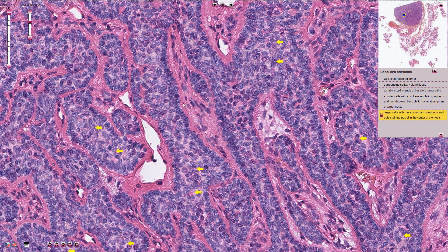In the center of these nests we have different cells, and those are larger with more abundant cytoplasm and with pale staining larger nuclei.